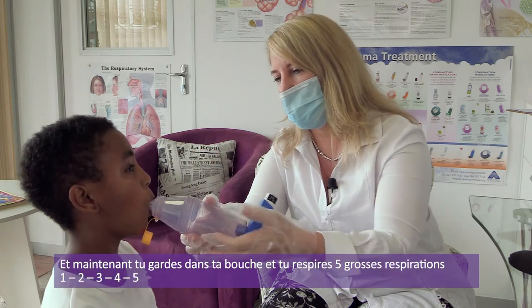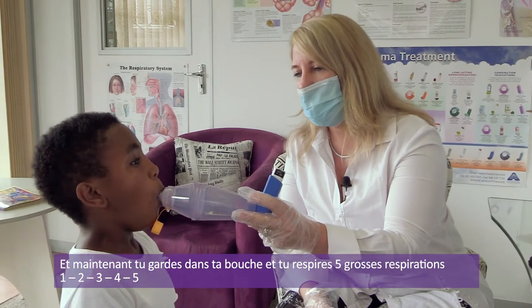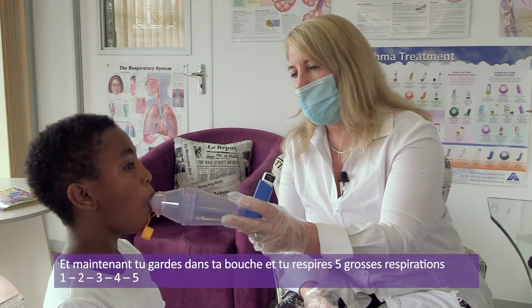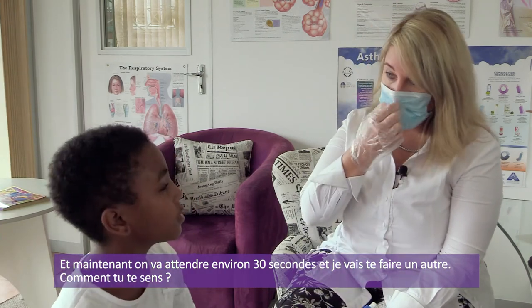Breathe in and out into the device 5 times. Big ones. That's it. Big ones. 2. Big one. 3, 4, 5. Okay, hold on a second. So now we wait about 30 seconds and then I'm going to give you another one.